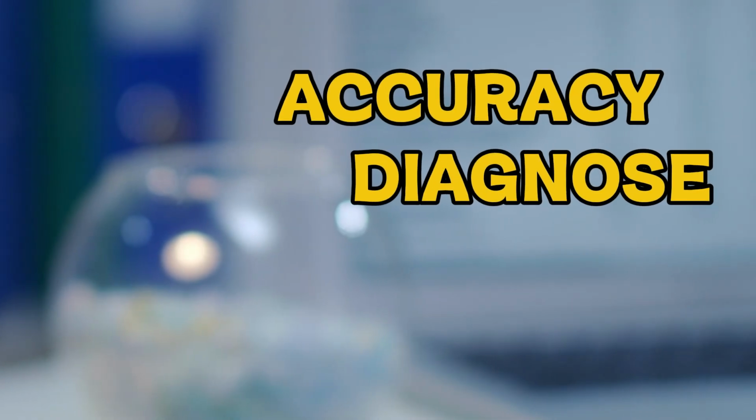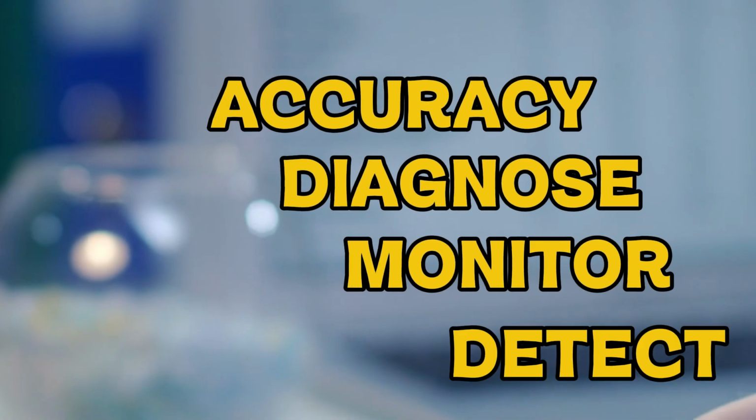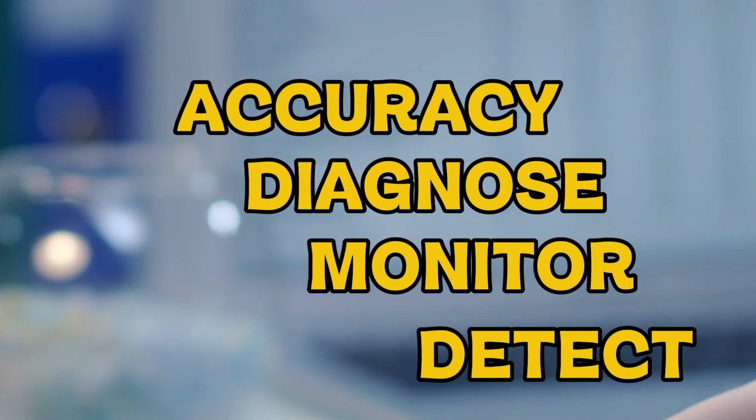It is also used to check the accuracy of automated platelet count results, help diagnose platelet-related disorders, monitor a patient's response to treatment, and detect platelet clumping that may affect the count. Overall, it provides important information about the patient's blood clotting ability and overall health.